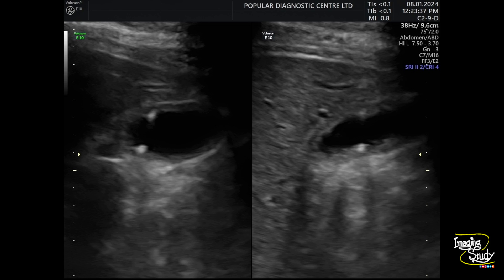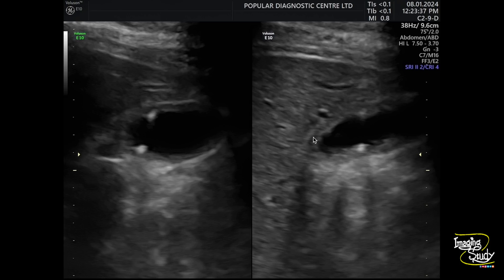But with a little higher frequency we have seen tiny cystic spaces here also. These are actually not vessels but cystic spaces within the gallbladder wall, which may be seen in adenomyomatosis.